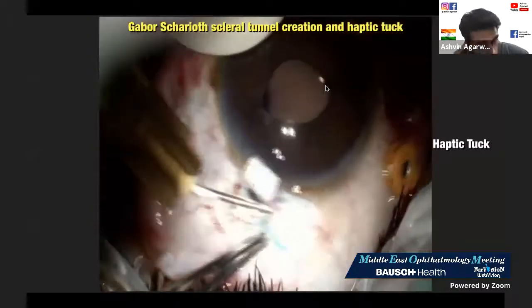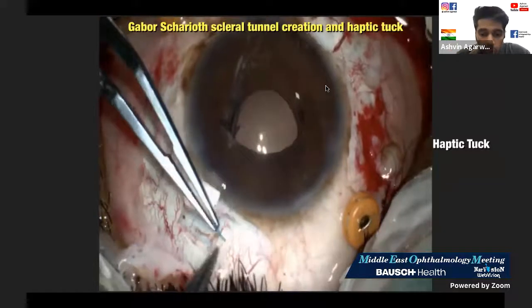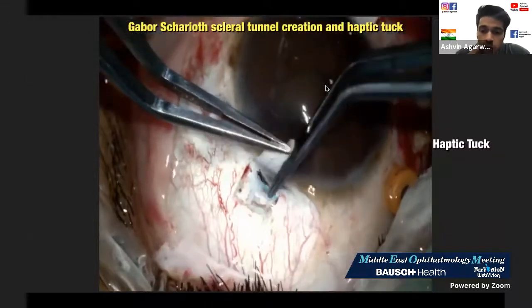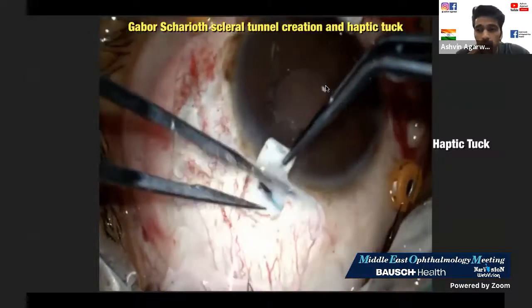I make my groove on the left side, and this is probably tougher. If you hold parallel and pull back, it will start going upwards. Here I hold in a sideward fashion and push it in. This is a very small trick, but it's such an important trick.